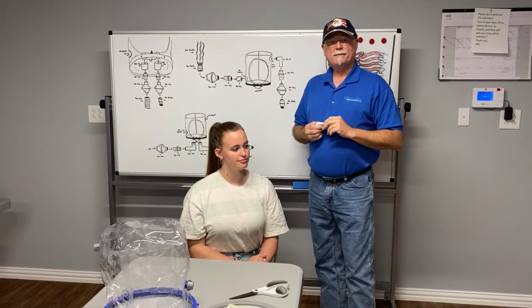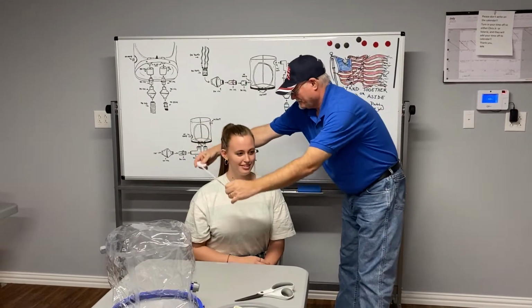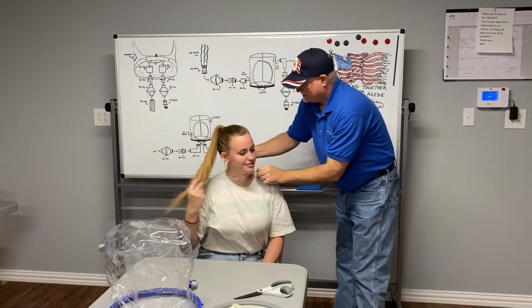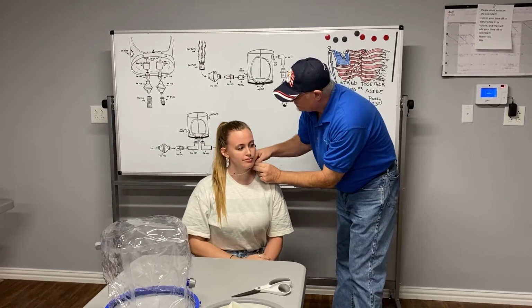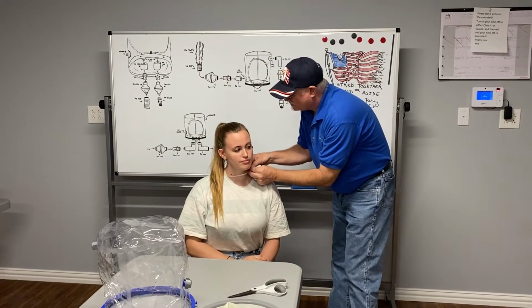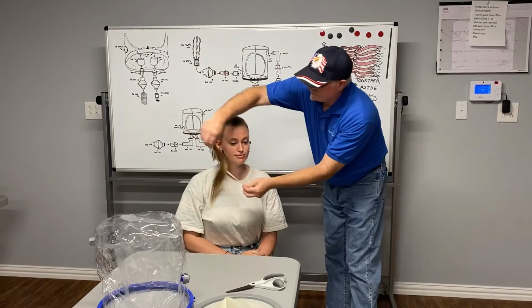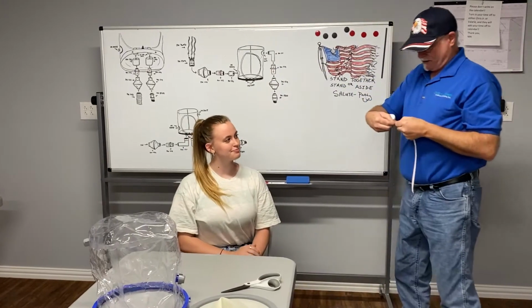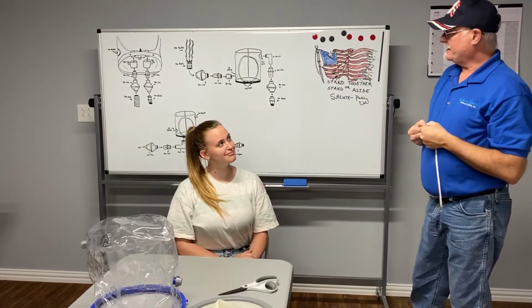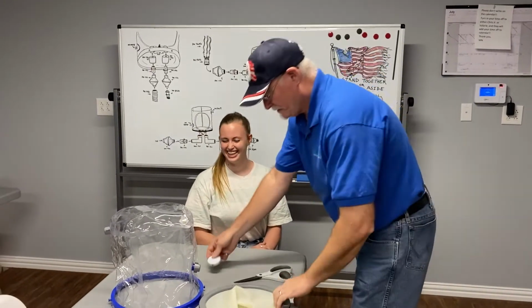First, we're going to measure the patient's neck. This is our patient. Pick your hair up, please. We'll bring it around. See where this touches on the equipment that we give you. Now I know that your neck is a 13 1/4. You might say that for later.